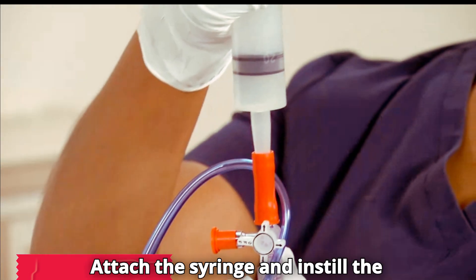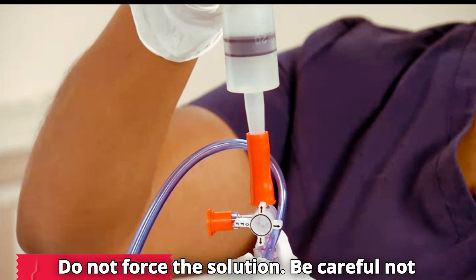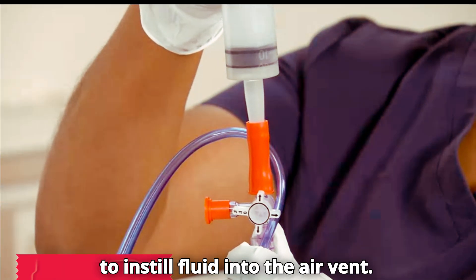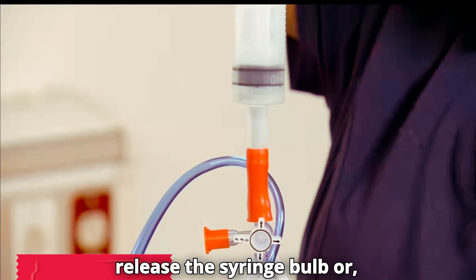Attach the syringe and instill the irrigation slowly into the NG tube. Do not force the solution. Be careful not to instill fluid into the air vent. Lower the end of the NG tube and then release the syringe bulb.